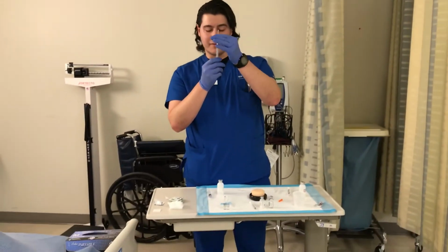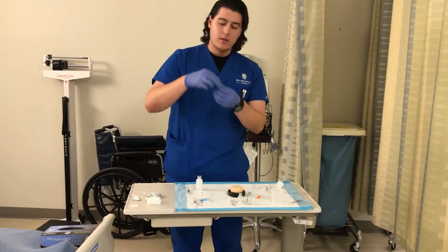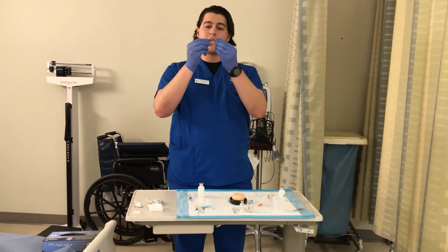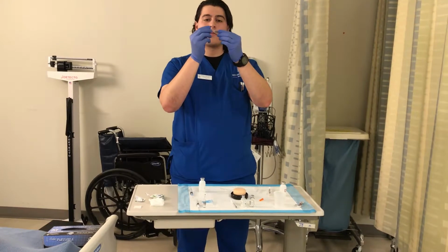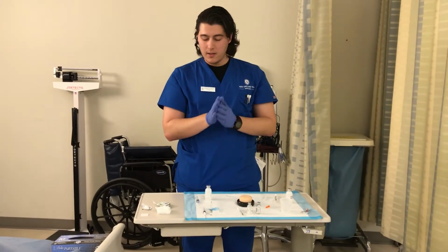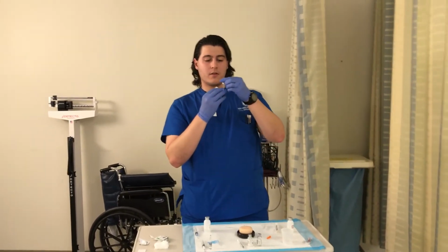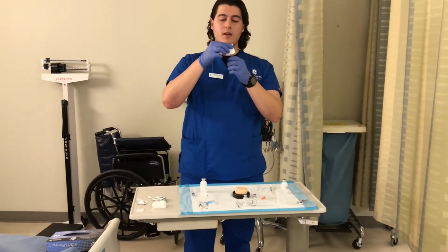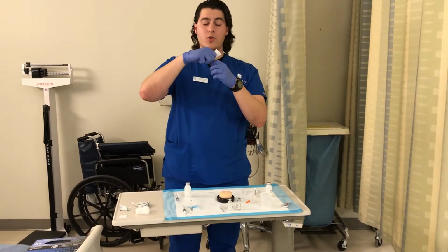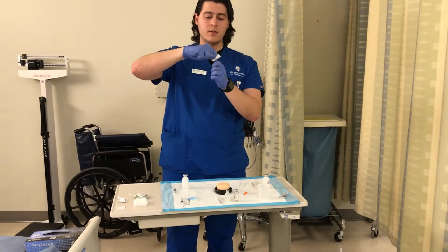Syringe will look like this with the filter tip on top. In order to use these ampules, you have to turn the ampule upside down first to get the medication all combined. You can roll it to combine the medication. You can never shake it. So once you've got all the medication together, you're going to break it away from you, so debris doesn't hit you. So use the gauze and break that.